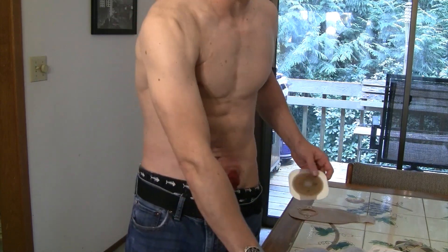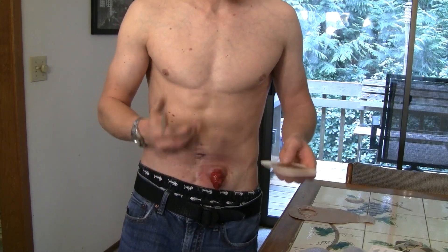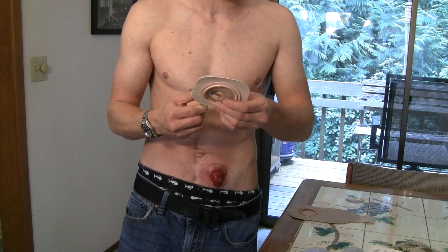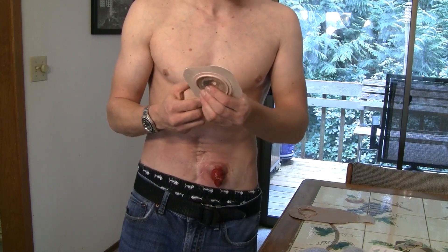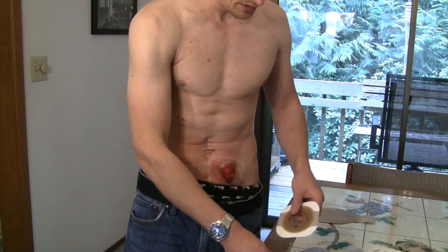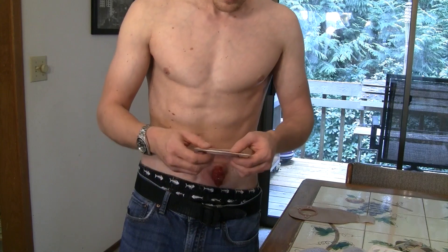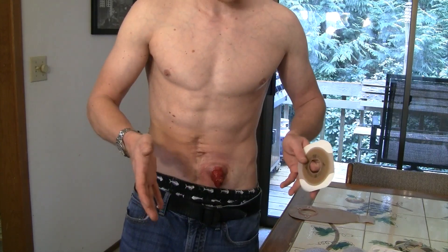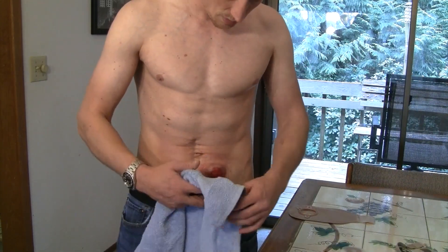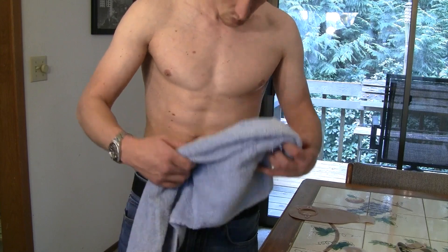Another great tip I learned from my ostomy nurse: be really adamant about drying your stoma before you put your wafer on. The more moisture around your stoma that gets onto the wafer, the easier and faster it's going to come up off your skin. Try to dry your stoma as thoroughly as possible. Paper towels do a great job.